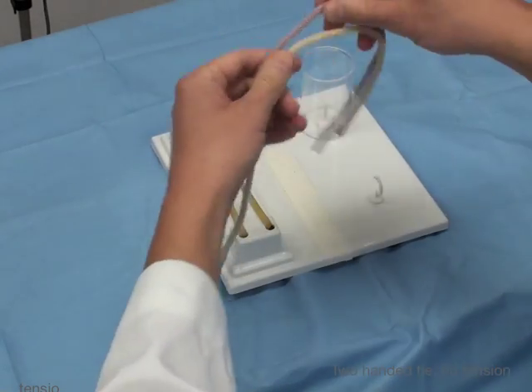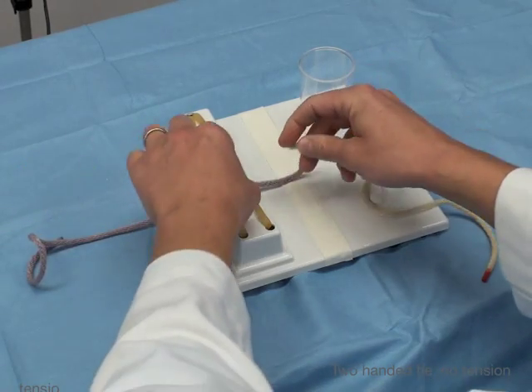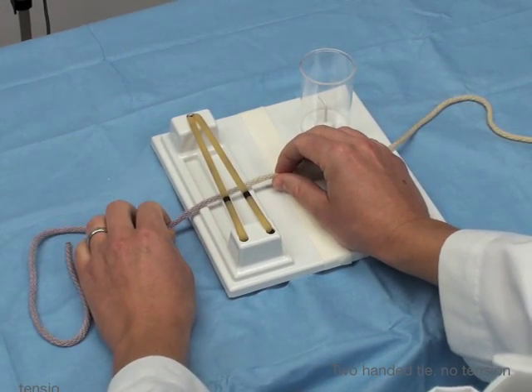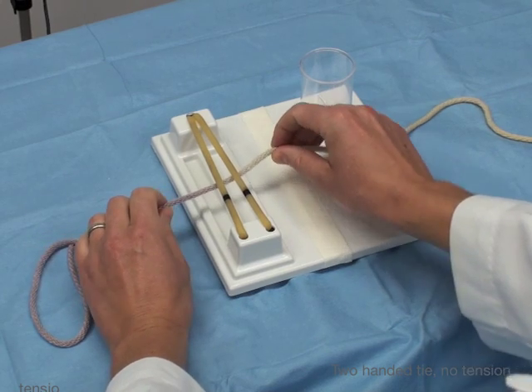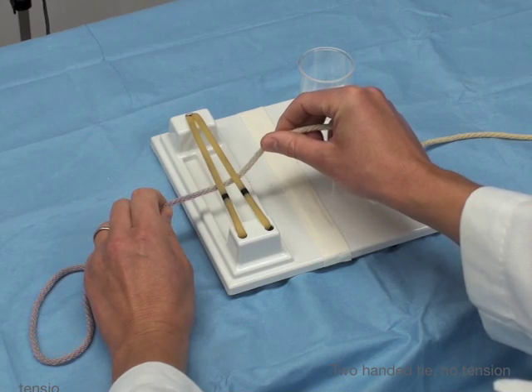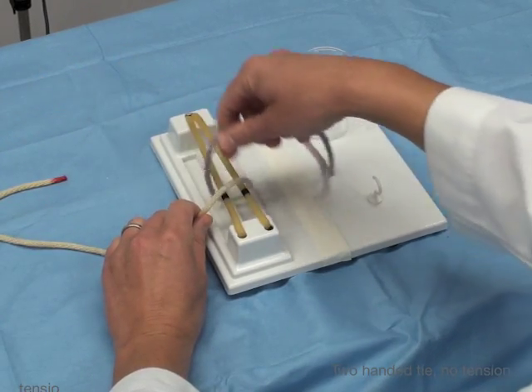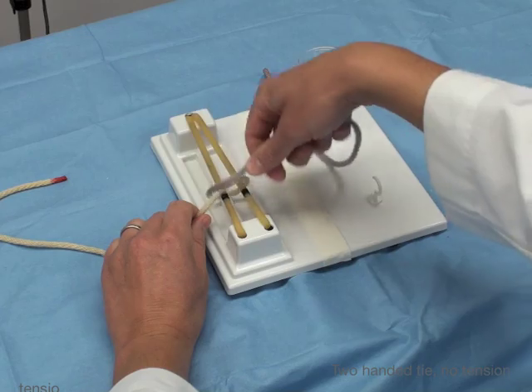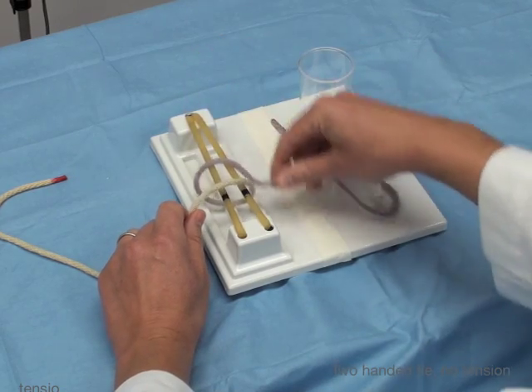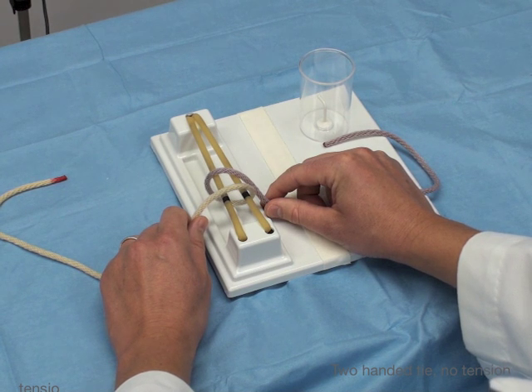I'm going to take this large thread to show you how we go about this process. What you want to do is set up your throw. The hand that is doing the suturing — the hand that's doing most of the work tying the knots — that hand should have the strand you want to cross. That strand should be distal to you. So now we're set up. This is the purple strand in this case; this is distal to you. That's the one that's going to be doing most of the work in the tying.